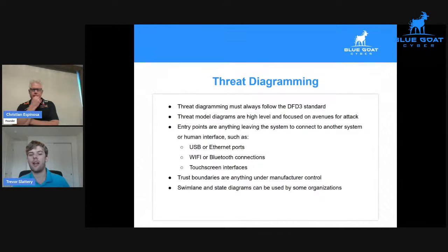Someone can try to hijack those signals. Someone can try to manipulate connections into there and interfere with the device remotely. I think especially when we're seeing wireless interfaces, the risk can go up a little bit, since then you don't have that same requirement of having your hands on the device. You can be in another room or on the same network, or even sometimes just halfway across the world, as long as the device is on the internet.